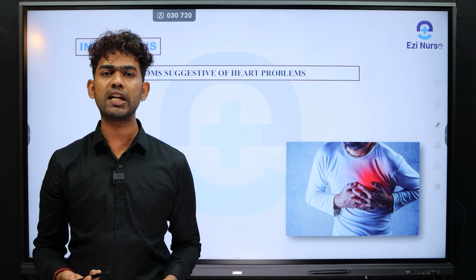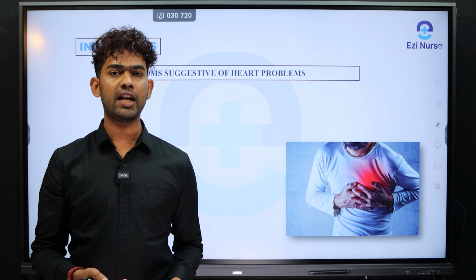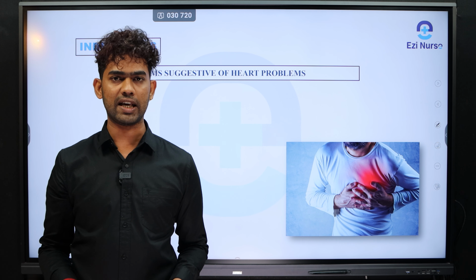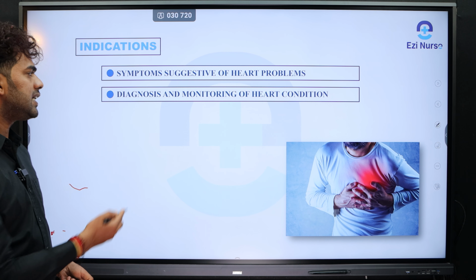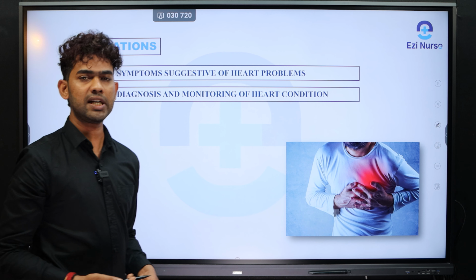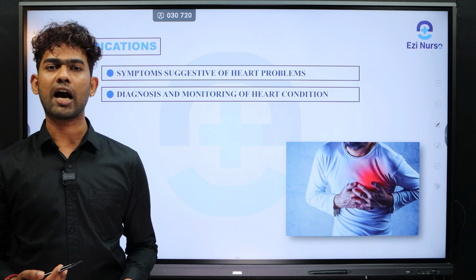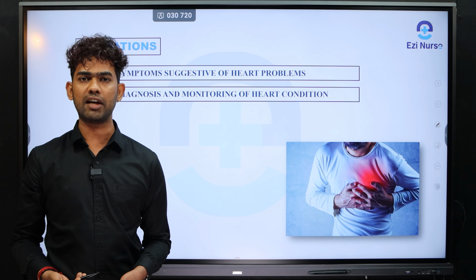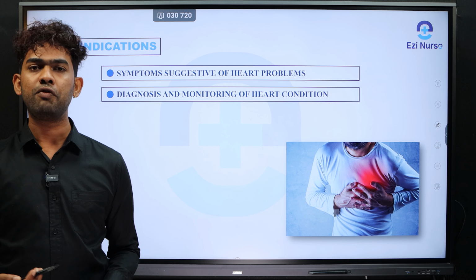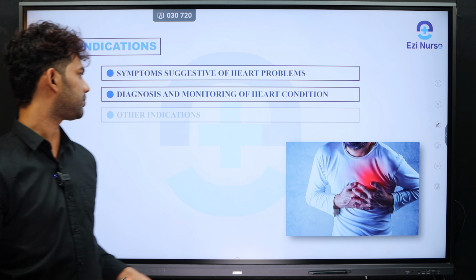Next, if the patient is feeling tiredness, restlessness or fatigue, then we should recommend the patient to do the ECG. Next will be the diagnosis and monitoring of heart conditions, especially diagnosing cardiac dysrhythmias, and after cardiac surgery, if the patient is having a pacemaker, we should perform the ECG to assess the heart function.